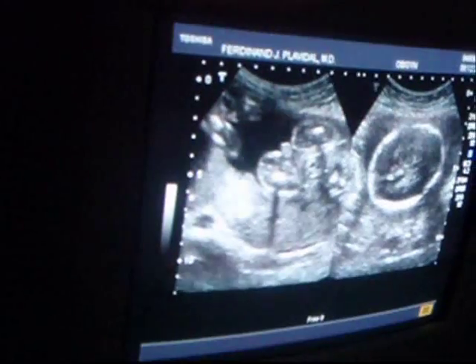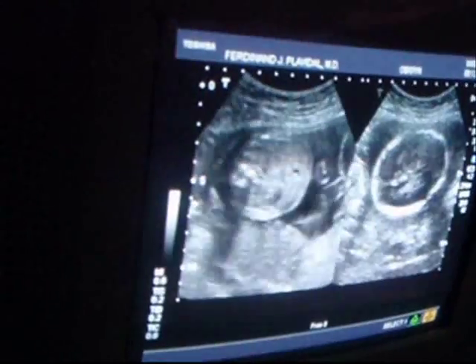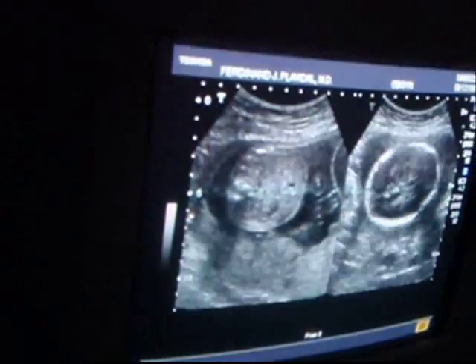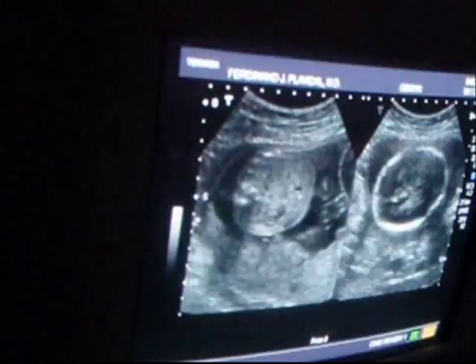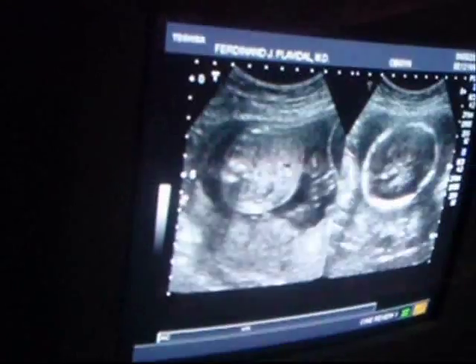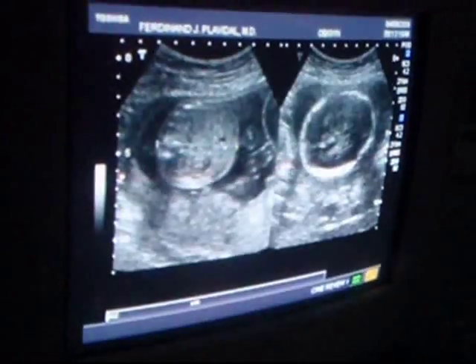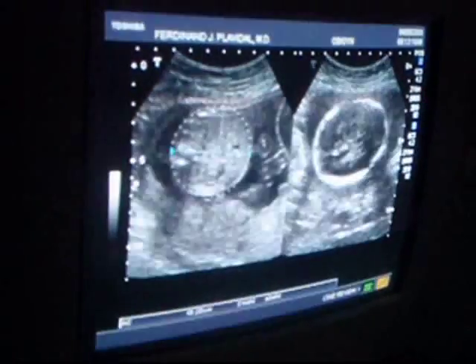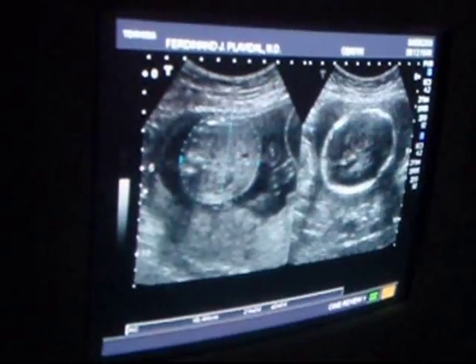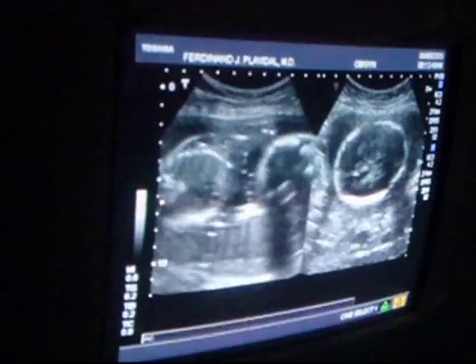We'll go ahead and pick on over here now and come down into the abdomen right there. Really nice view, circular abdomen, and we're going to ask the machine for the abdominal measurement right here, and again, here's the spinal column in the back, the abdominal wall. I do this a lot faster as you get further on because it gets real uncomfortable lying flat. Okay, and then we're going to unfreeze this now.